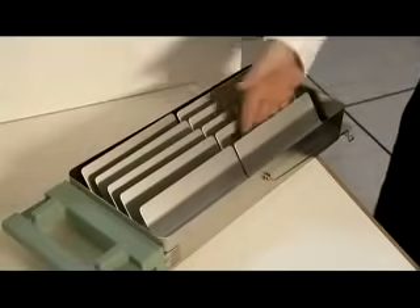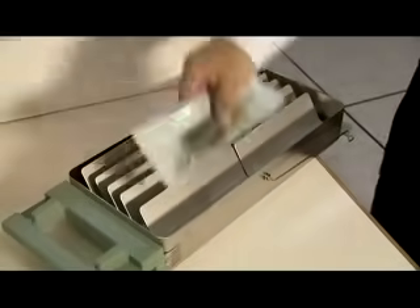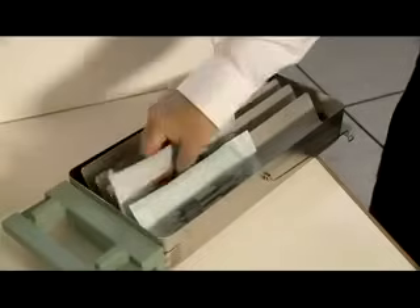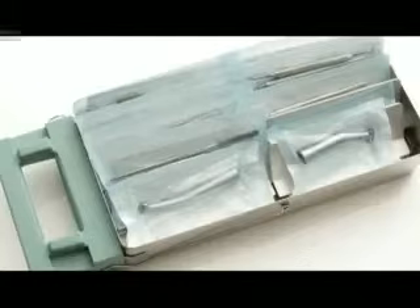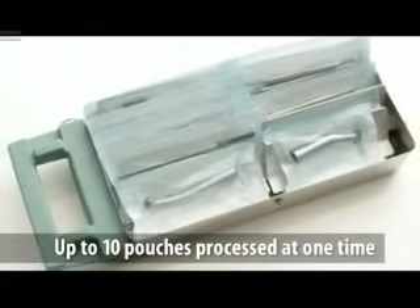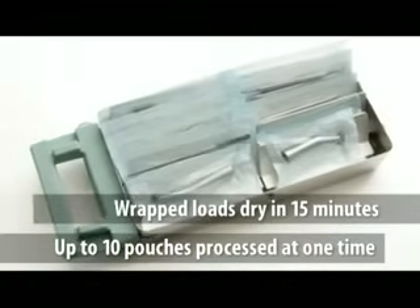Arrange the Stat Dry plates lengthwise as shown rather than side to side. Correct placement ensures more effective drying and permits a smoother and more efficient air flow around the pouches. Up to 10 pouches can be processed at one time. Wrapped loads dry in as little as 15 minutes. You will find the Statum 5000 is the perfect blend of speed and capacity for growing practices.